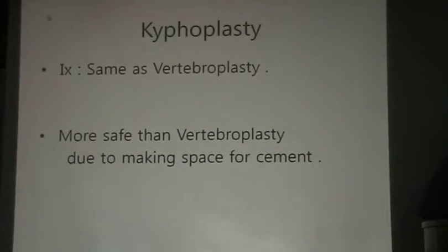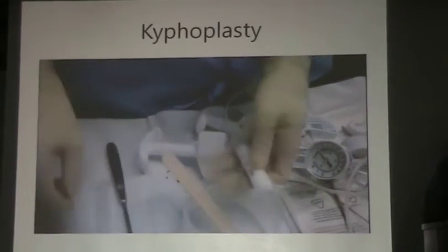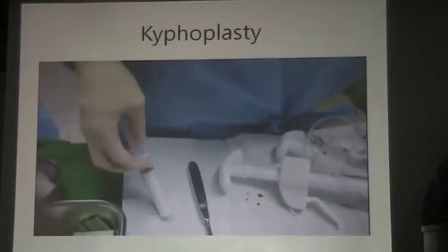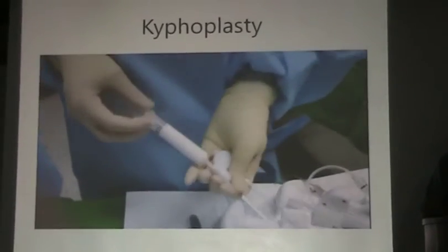Next topic is kyphoplasty. Kyphoplasty indication is the same as vertebroplasty, and kyphoplasty is safer than vertebroplasty due to making space for cement. And in kyphoplasty, my scrub nurse prepares the bone cement. Kyphoplasty needle.